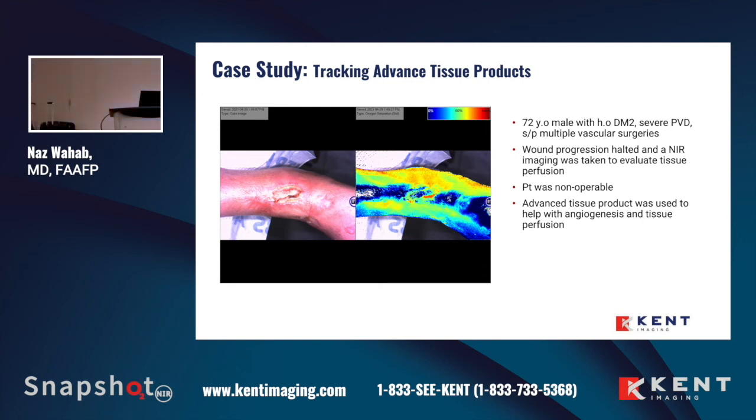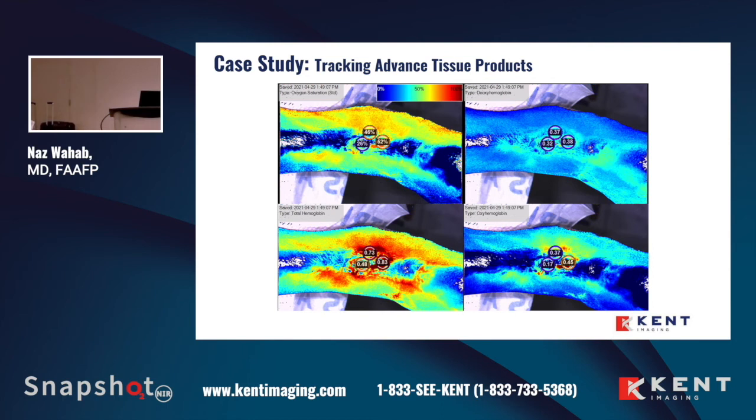I didn't know if that was just some sort of glare off of the camera, what was happening. And so I wanted to really be sure that there was something a little bit more happening, and that we were really getting the depth of penetration that the machine is supposed to be giving us. And so the oxygenation was obviously not so good. But we could see the total hemoglobin was there. So I could see that. I don't think that this was just the error of the machine itself off of a glare, but that there was some imaging happening underneath that skin.